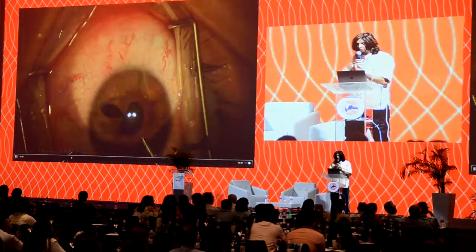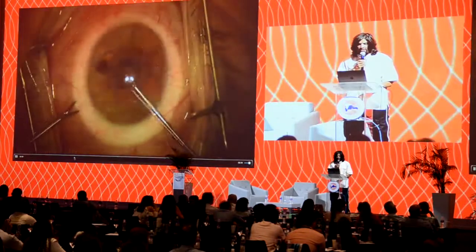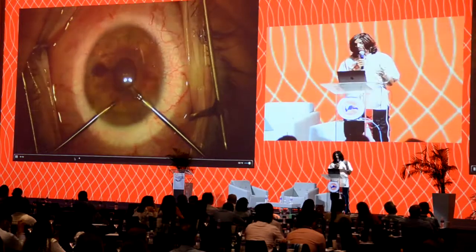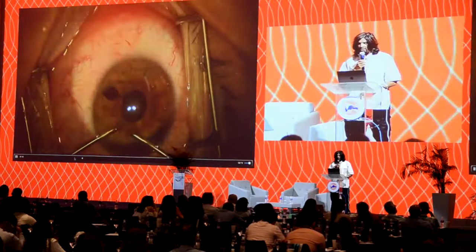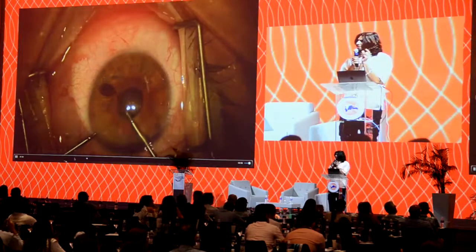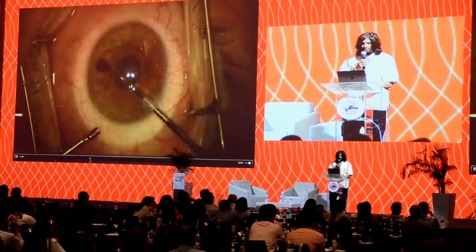And that basically is using micro instrumentation to do this by bringing the iris together. And then we can lock the suture by again taking that long suture on the left side of the field here, doing a backhanded loop to again lock it and grab the short end and pull. Remember, we have to keep the idea of the incisions as a fulcrum, avoid tension and torquing of the wound, and we can then lock that suture.